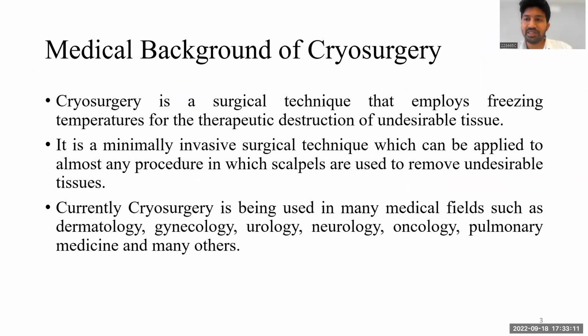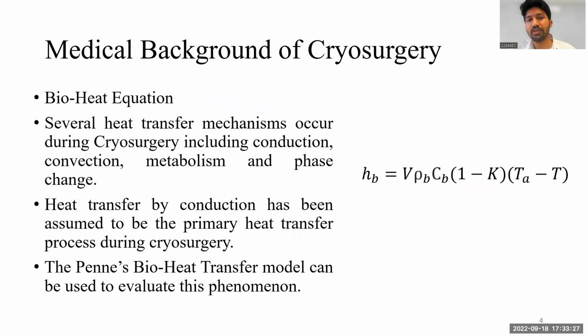So, cryosurgery is simply the selective exposure of tissues to extreme cold and hence causing the destruction or elimination of abnormal or malignant cells. So, this is a minimally invasive surgical procedure. Some might call it a non-invasive surgical procedure as well, but it actually depends on the type of application we're using it for. So, we talk about the medical background of cryosurgery.